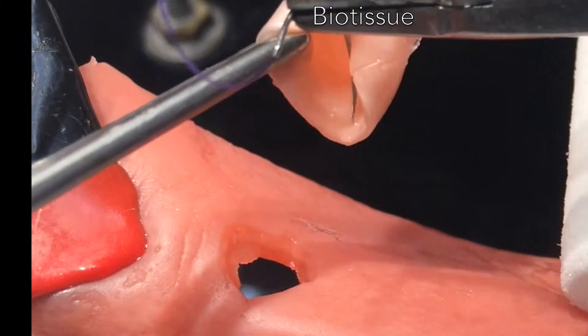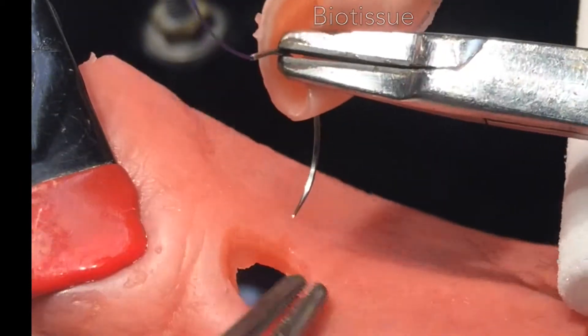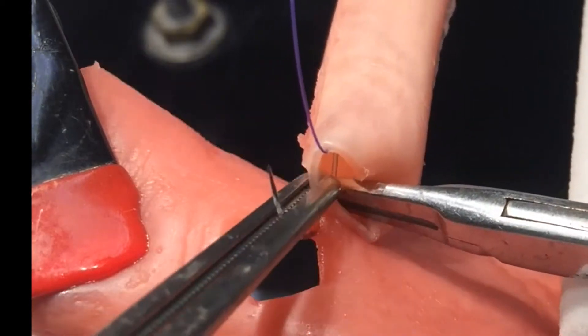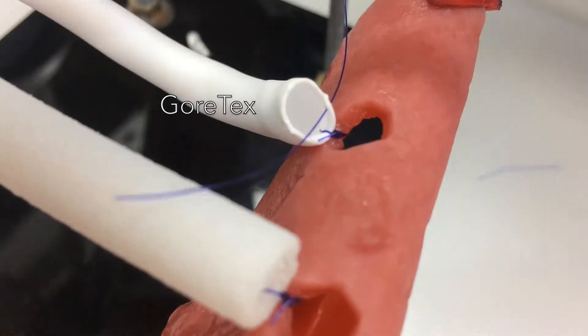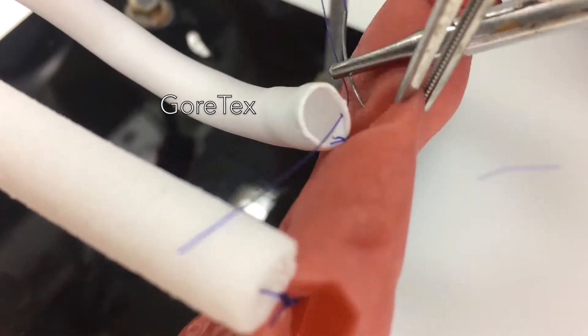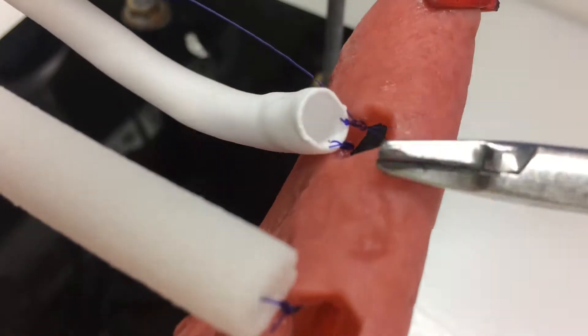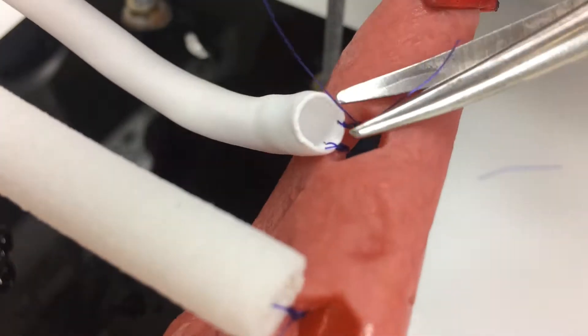And that's what makes the biotissue more realistic. The needle passes through easily — the material is so flexible that you can pass through immediately. The Gore-Tex material is really nice for suturing, but it doesn't really damage easily, and that makes it less realistic.